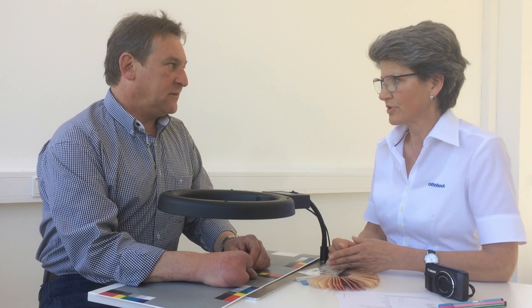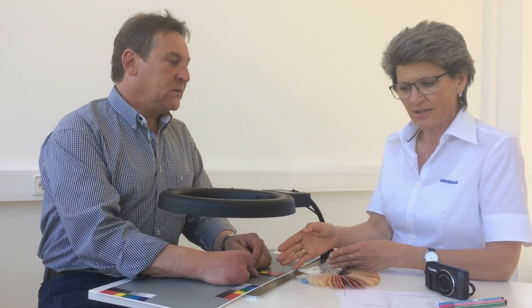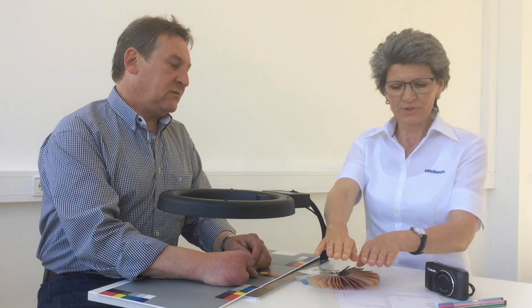The user should be in a relaxed position with their elbows slightly higher than their hands, which are resting on the table. When one hand is raised and the other is next to the body, blood circulation creates very different colors in each hand. Color determination represents just one moment in time.